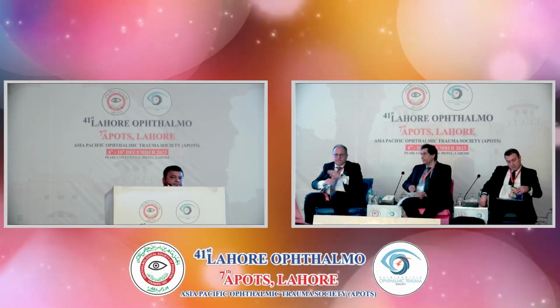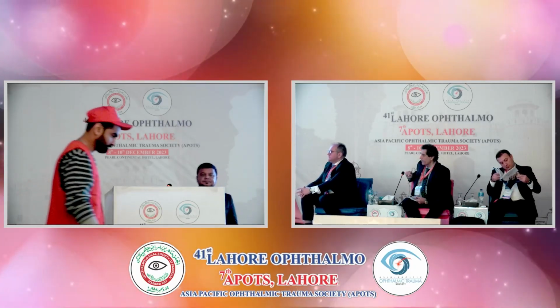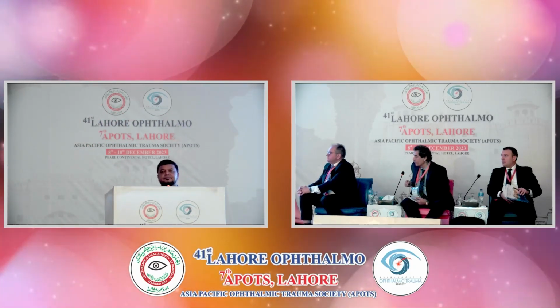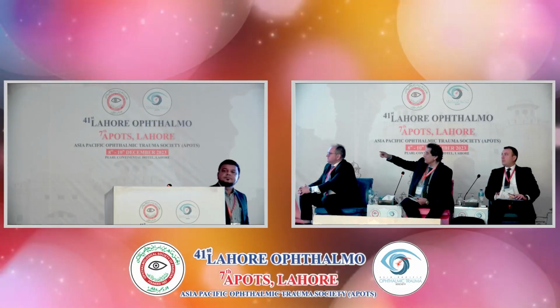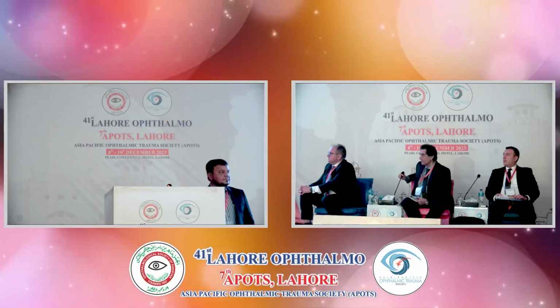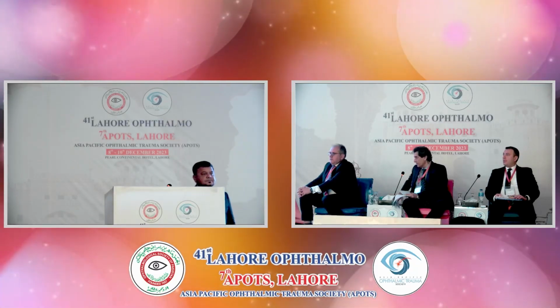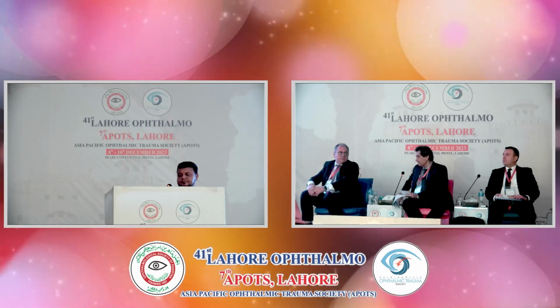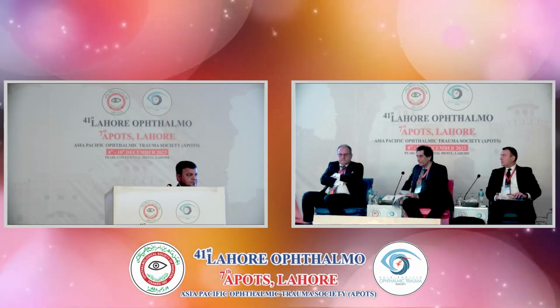You're welcome. There's a question there? Can the gentleman have the mic, please? To me, it looks not right to cut the macula. Yes, interesting technique, very nice.